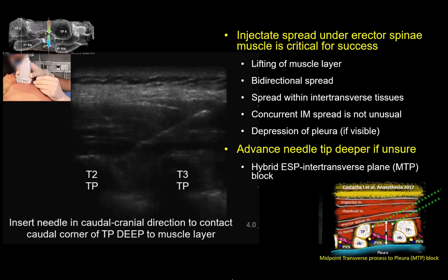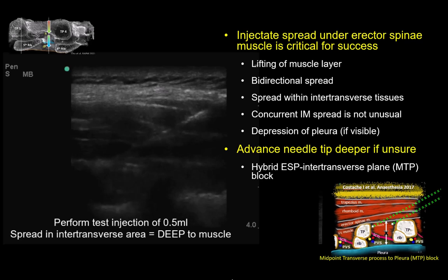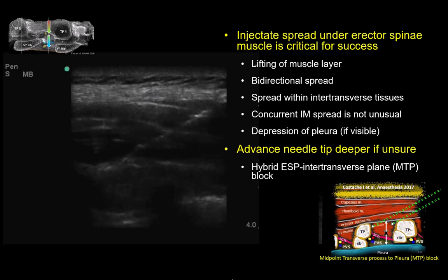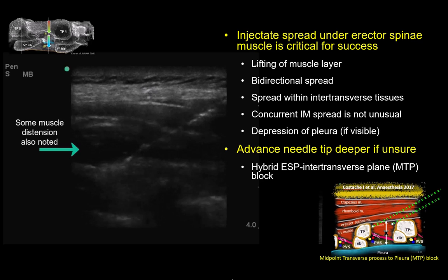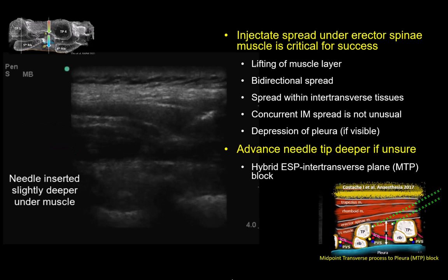It is acceptable to end up imaging a plane through the neck of the rib rather than the tip of the transverse process per se, because we're primarily interested in somatic sensory block of the ventral rami or intercostal nerves in this clinical setting. The key is to ensure that the needle tip is deep to the overlying erector spinae muscle, as evidenced by spread under the muscle rather than within it. If you have any doubts about this — such as muscular distension — then advance the needle a little deeper.